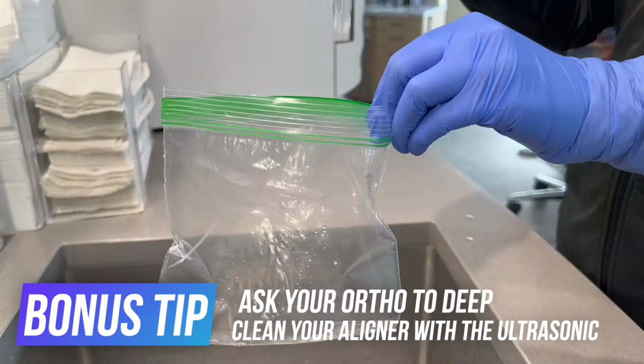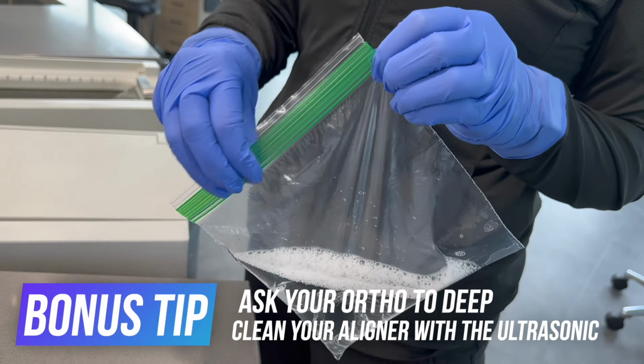Also, if you're going to be in an aligner for a long period of time, you could request that your orthodontist uses what's called an ultrasonic machine to deep clean the aligner, and they are usually able to do that for you upon request. Next, here's what to do if you lose an aligner.